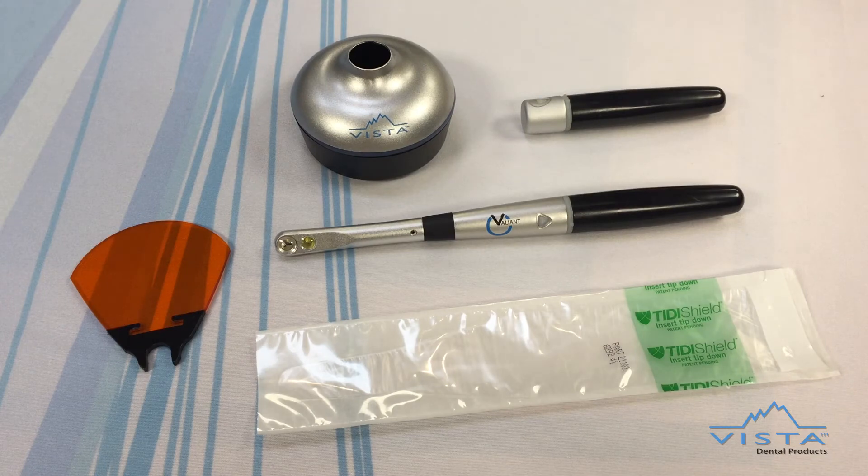Vista Dental Products introduces the Valiant LED Curing Light. The power to confidently cure is here. The Valiant produces a uniform beam of high intensity light in the 395 to 500 nanometer wavelength range. This multispectral curing light enables Valiant to polymerize nearly all light cured dental materials.